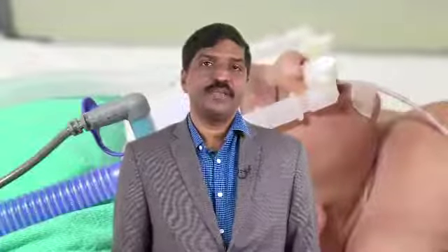The heating of gases to 37 degrees Celsius occurs in the water chamber of the humidifier and the gas heating from 37 to 39 degrees Celsius occurs in the inspiratory limb by a heating element present in the inspiratory limb.